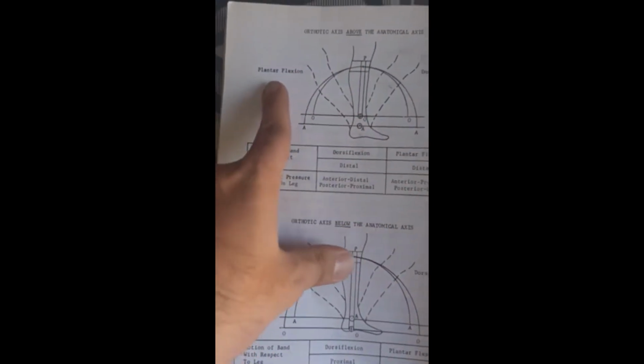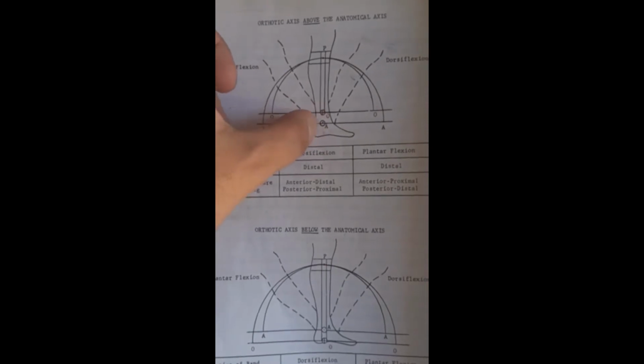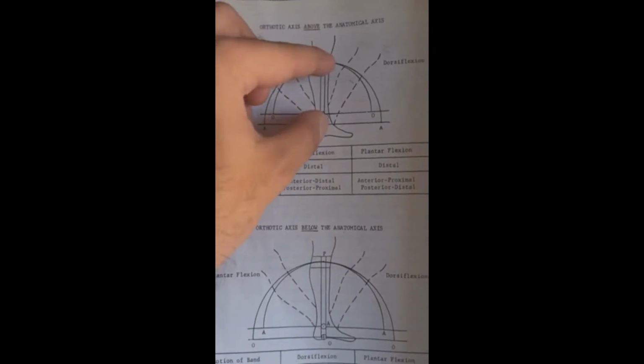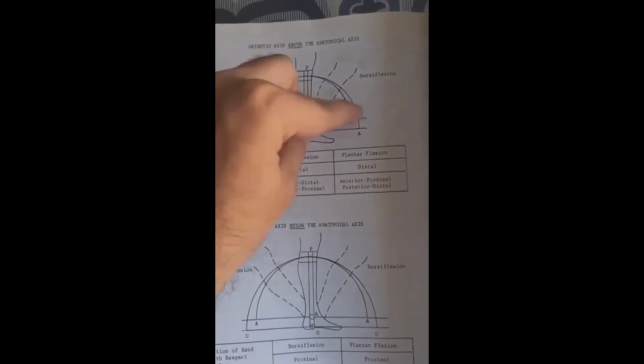That is plantar flexion. How can we make this arc? We can make this arc by putting our compass pin on A and our pencil or marker on P, and making an arc of A as well as O.